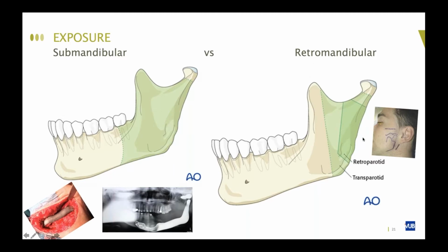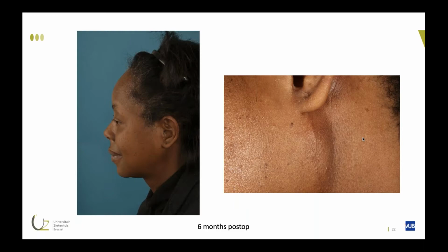Besides the transparotid, there is also the retroparotid, Biglioli Coletti, so-called mini retromandibular retroparotid approach. I've used it for TMJ replacement, but I do not recommend it. When you start out, use the submandibular, so-called Risdon approach. However, a mini retromandibular approach may result in quite unnoticeable scars.